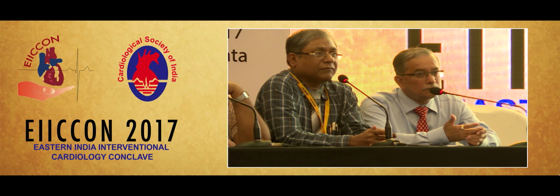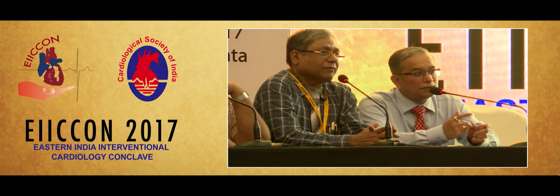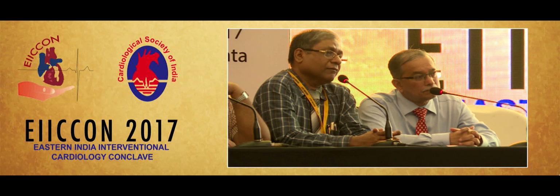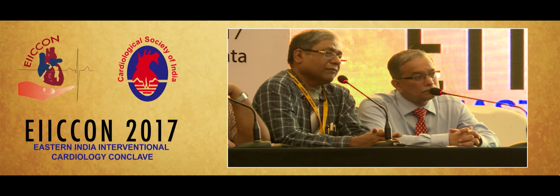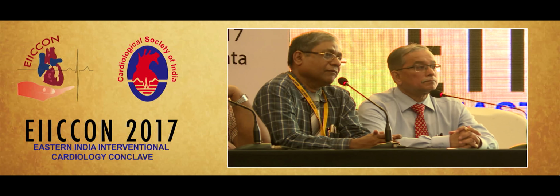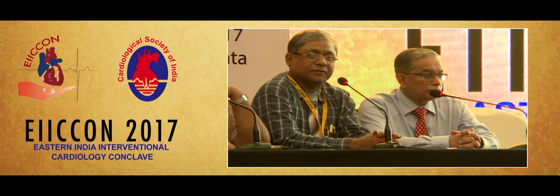Yes, thank you, sir. I think what Shirish emphasized in the last case also. So one thing, Dr. Dutta: there is some left main to LAD mismatch, some constriction there in the confluence area, no? You could have given another POT, a push dilatation, and that area is essential.